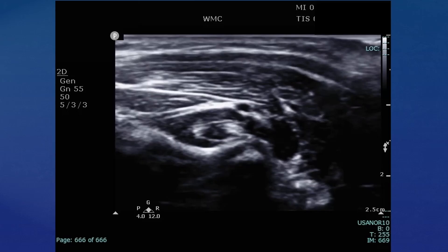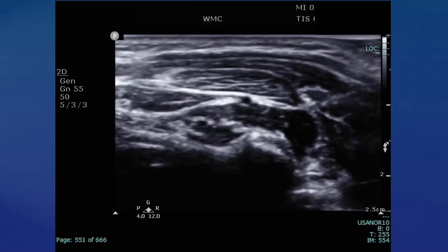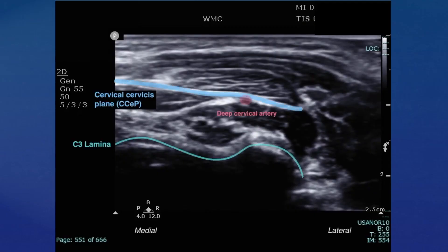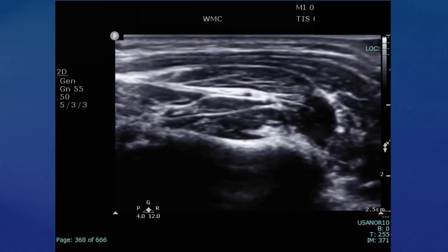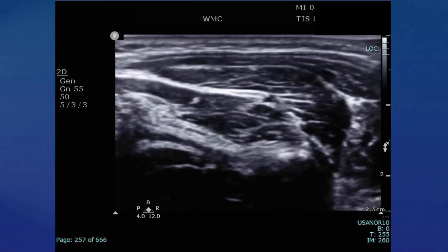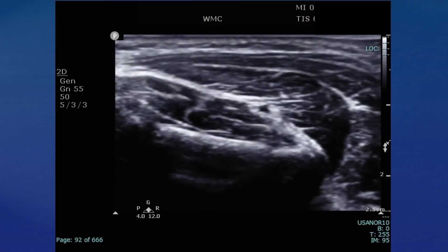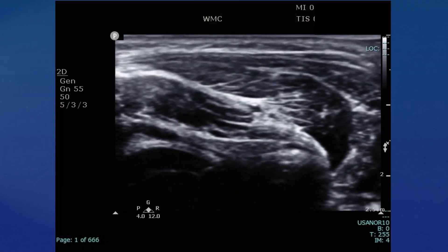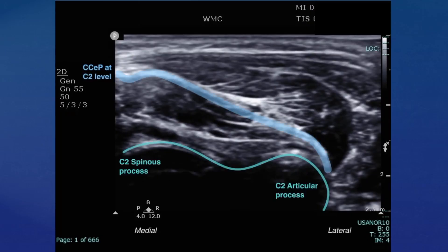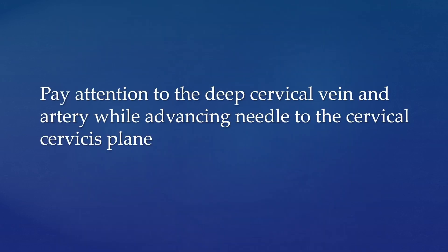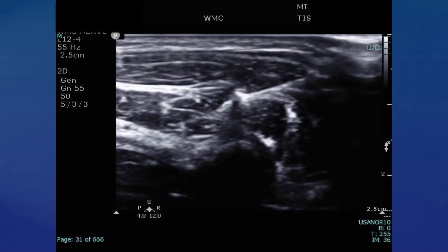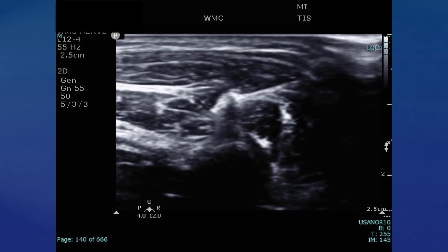This video demonstrates the ultrasound probe scanning from C3 to C2 level. You can see the local anesthetic injection at C2 level.